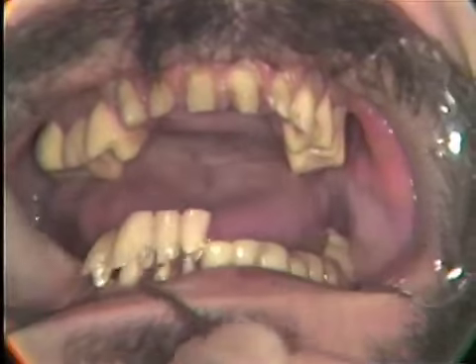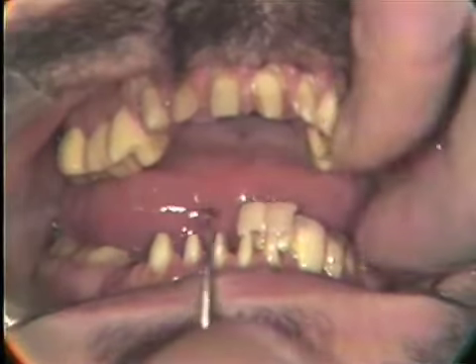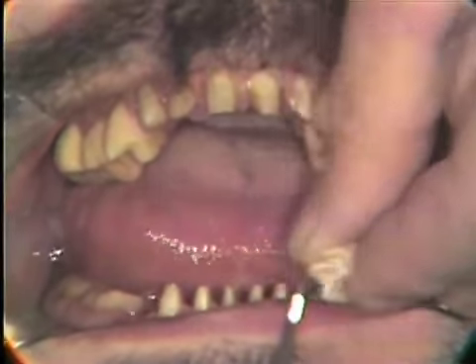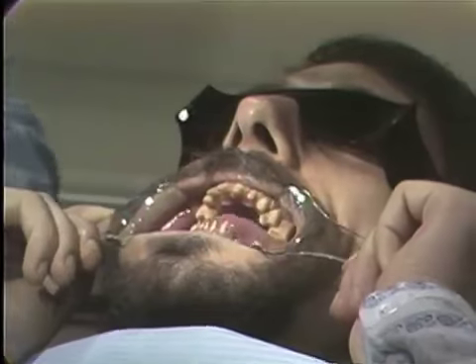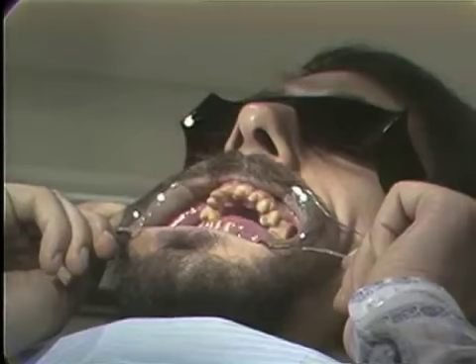So when you take the temporaries off for procedures of impressions, for taking bites, for transfers, and so on, always check the contour and the relationship of the temporary to the tissue and maintain a healthy situation. The temporaries are often neglected, but can be the key to success of any restorative case. To sum up the purpose and the key points of the temporary, the main function of the temporary is to protect the tooth naturally.